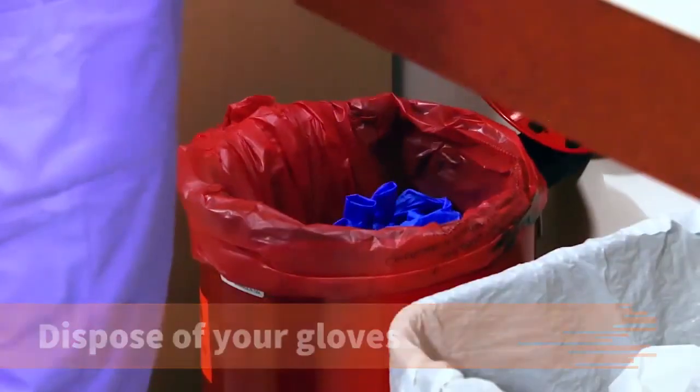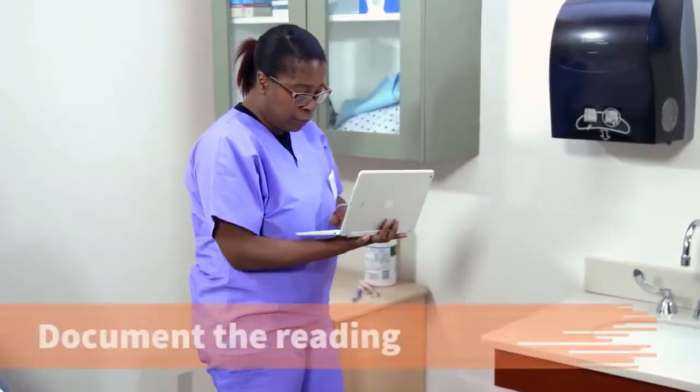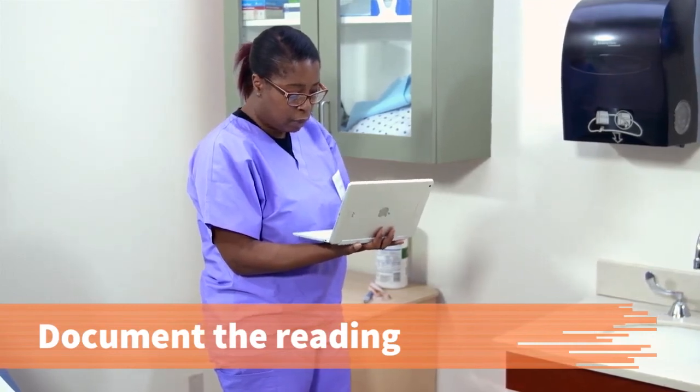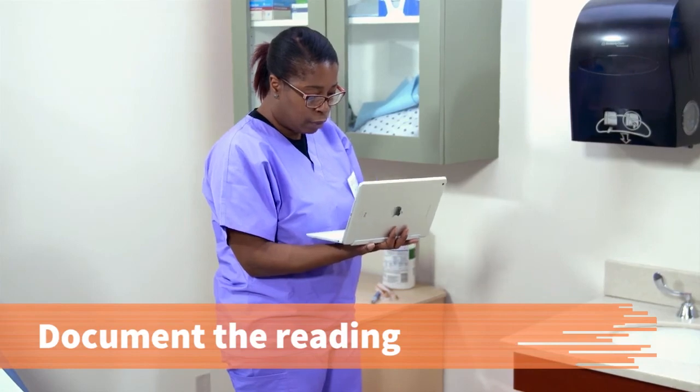Dispose of your gloves in the biohazard waste container. Then sanitize your hands. Document the reading in the patient's health record. Include the reason for the patient's visit, the arm read, the size of the induration in millimeters, and the provider notified.